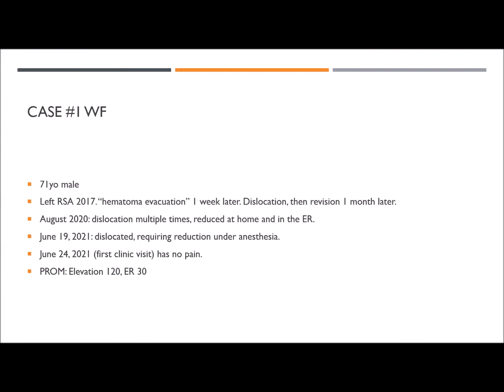I didn't like some of the outcomes from that, and so I changed my thought process to using a different design. More inlay on the humerus, and placing the base plate more along the bottom of the glenoid versus overhanging it. I think I like that better too. So yeah, similar thought process there.